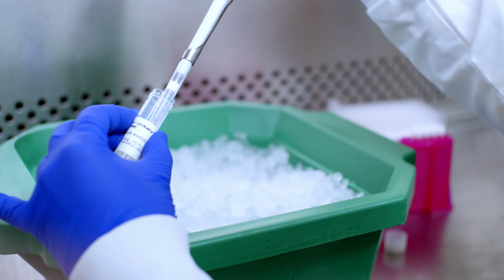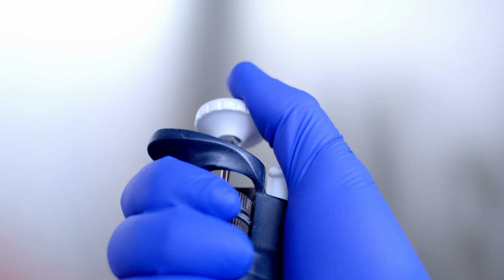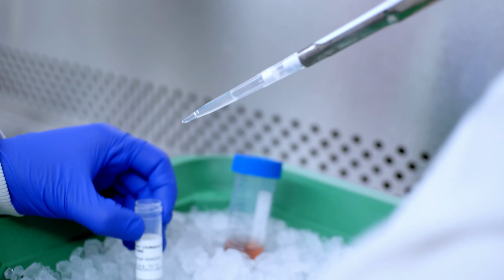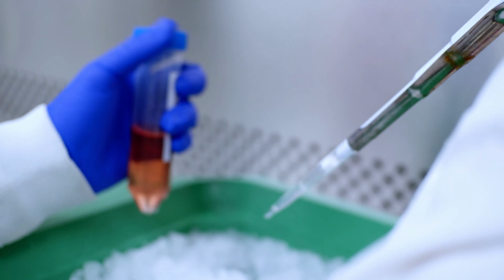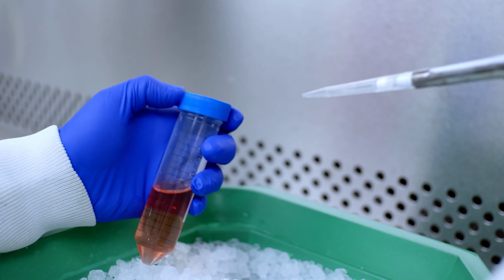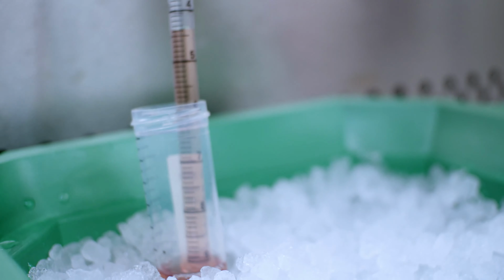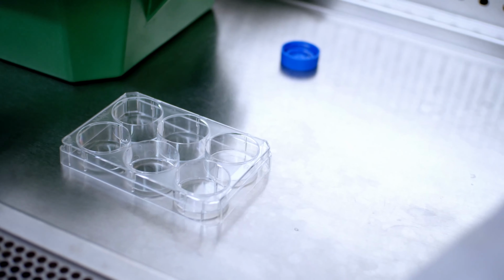Using pre-chilled pipette tips, mix thawed Cultrex BME by pipetting the solution up and down. Avoid introducing bubbles during this process. Dilute Cultrex BME to the desired concentration in cold serum-free medium. Optimal coating concentration may vary by cell type or application and should be empirically determined.